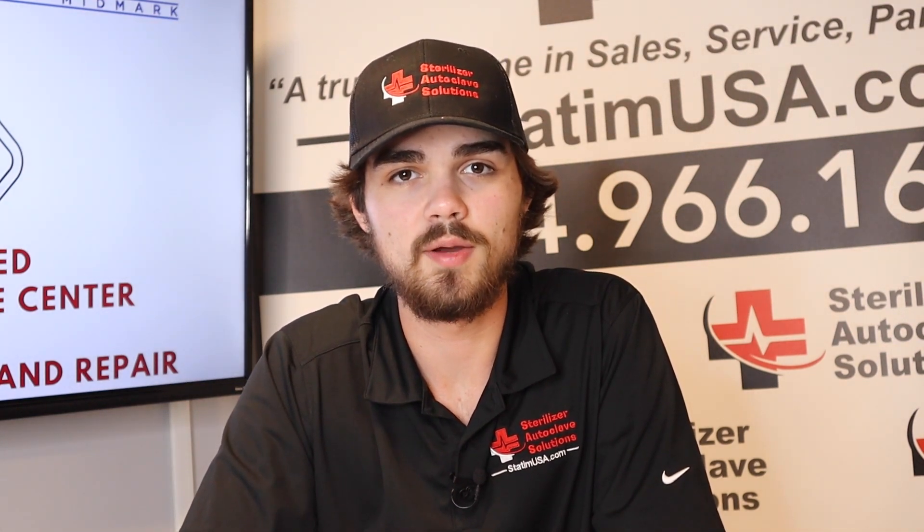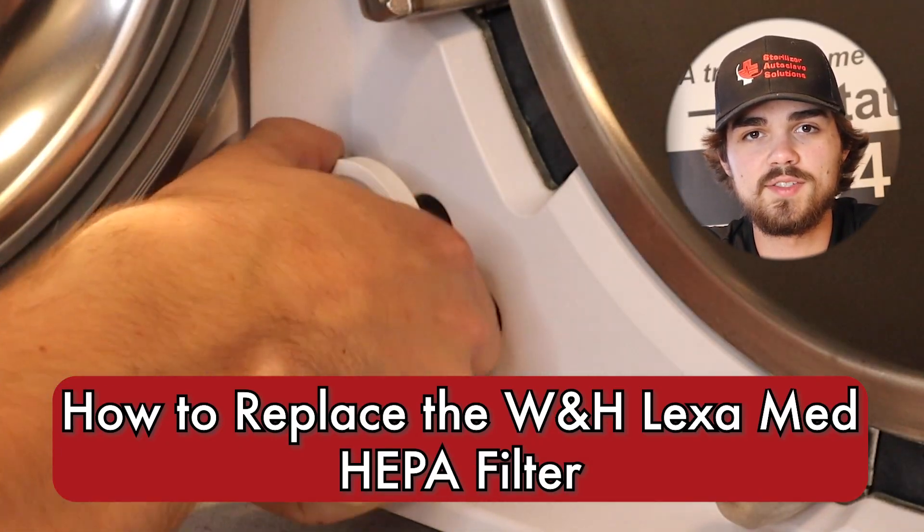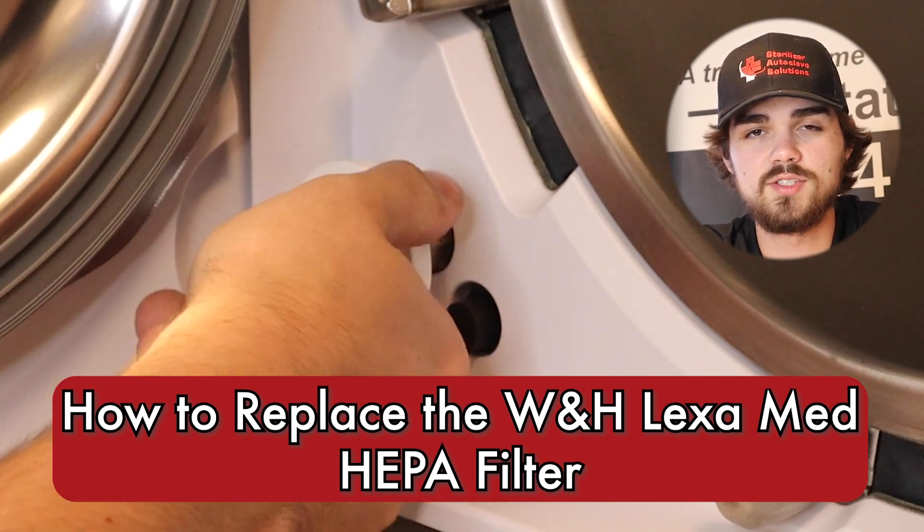Hi, this is Jacob with Sterilizer Autoclave Solutions, and today we're going to be touching on some W&H Lexa Preventative Maintenance. In this section, we're going to be looking at how to replace the HEPA filter on the W&H Lexa.